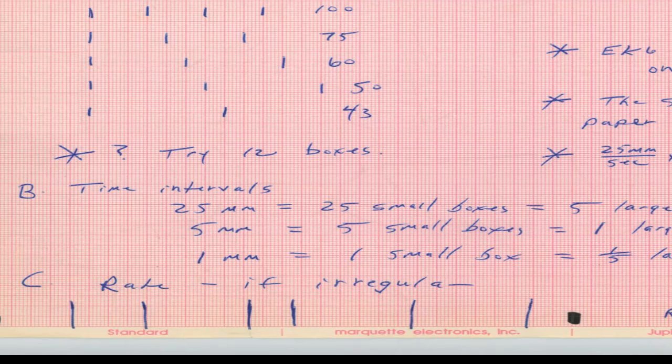Another way to get the rate, and again we'll practice this material, is to look at the bottom of the electrocardiogram, where you have pink lines going up and down, or vertical. What I've indicated here is some pink lines on the paper. If you go from one pink line to the next one, that's 3 seconds. You could go back and add up all the boxes if you want, usually done by large boxes. If you go another pink line over, that's a 6-second period.